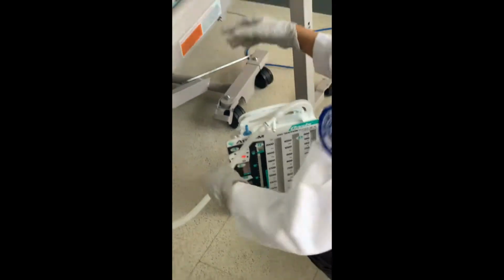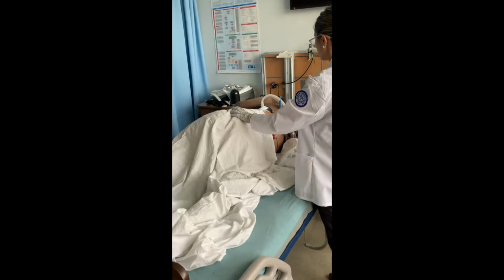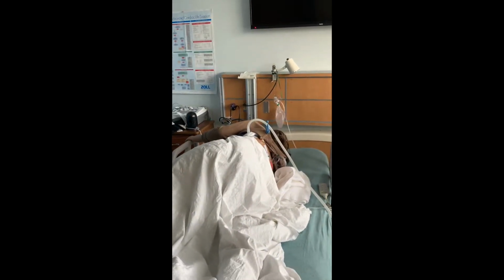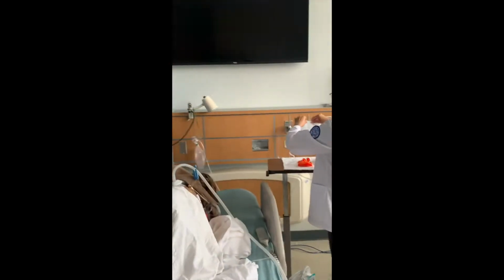Raise the bed and position the patient on their side. Remove and discard your soiled gloves. Perform hand hygiene and don PPE according to facility policy.